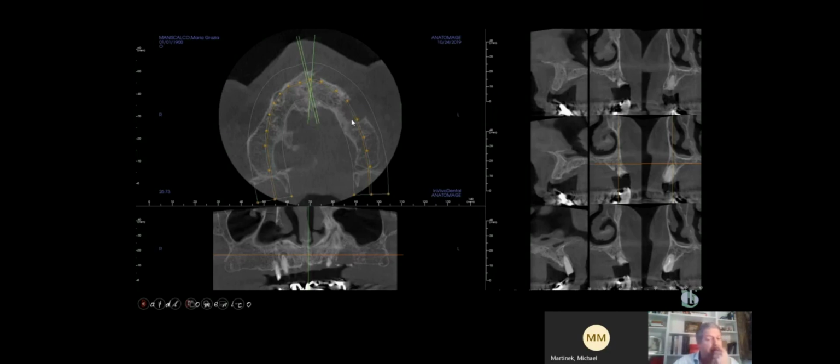Like here, where we have a resorption, a very big resorption of the bone. So, of course, we have to choose what we can do here. We can make a regeneration. Of course, the answer is yes, but we need to make more surgery. We can speak about a less invasive approach. The best thing is to be less invasive.